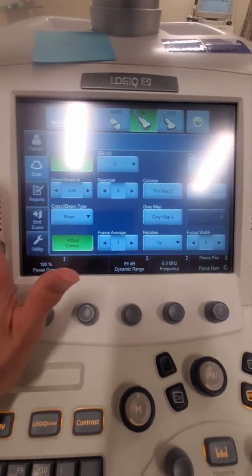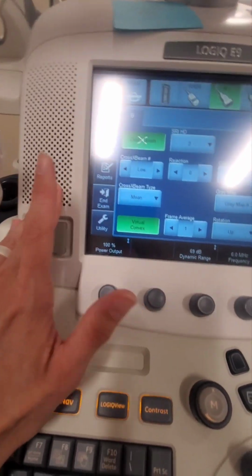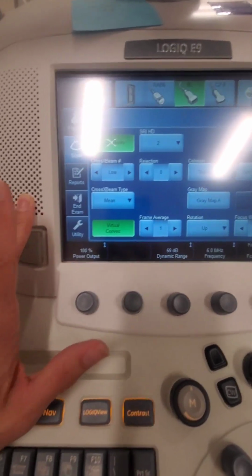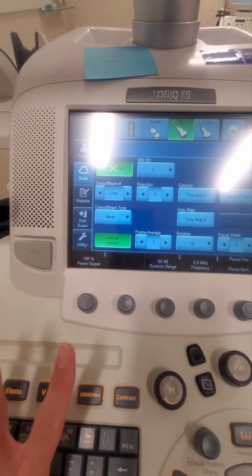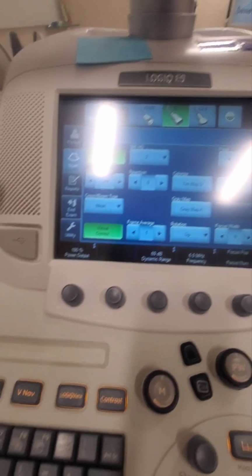Reports will be your worksheet at the end. End exam, that's pretty self-explanatory. Utility will get you into changing things in the machine that you probably don't need to do or worry about. Definitely don't need to for this video, okay?